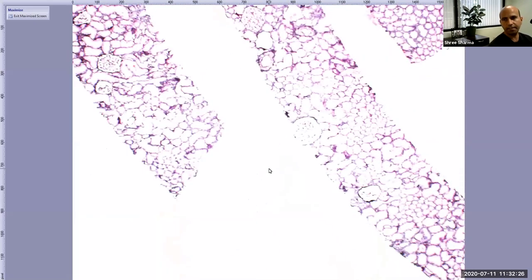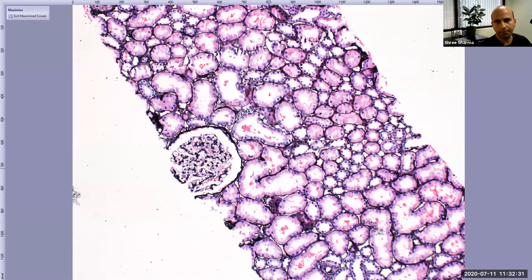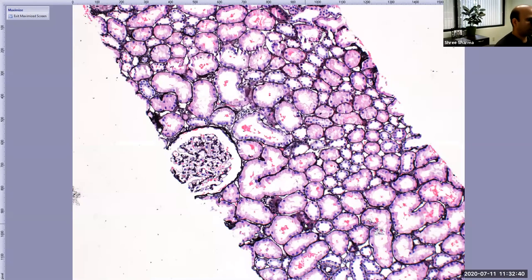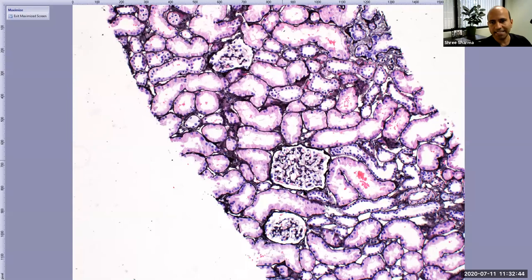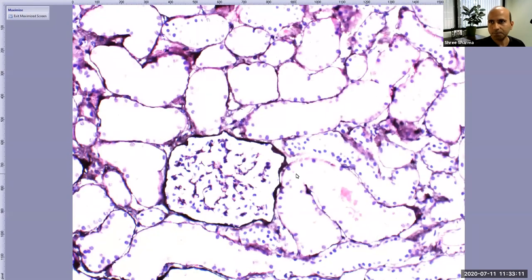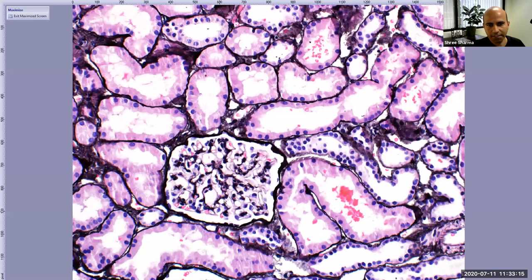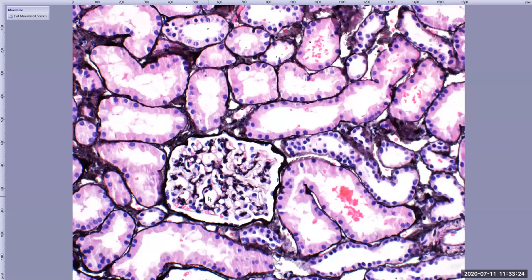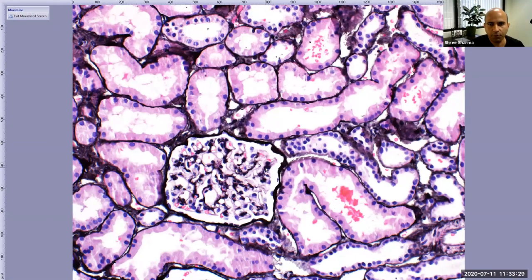As a pathologist you analyze all glomeruli, and that is where the concept of focal and diffuse comes up. This is another stain — much darker, all black — this is a silver stain. In this field you are seeing three glomeruli. If a disease involves 50% or more of the glomeruli, I call that disease diffuse. If a disease affects only a particular tuft, I call that segmental. This is also the best stain to identify the GBM.